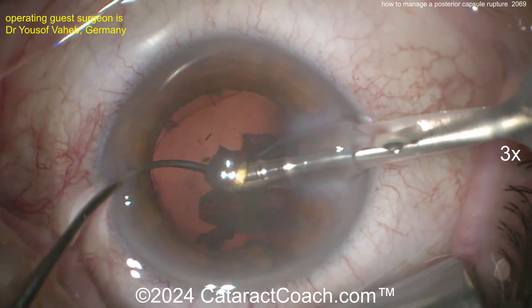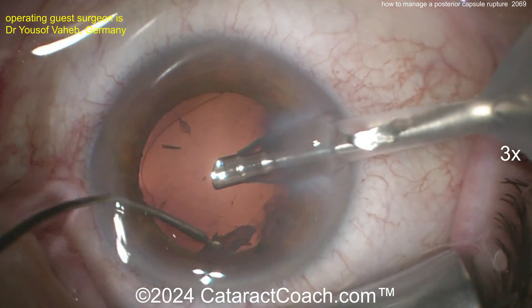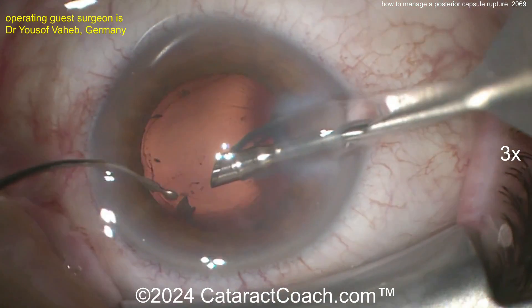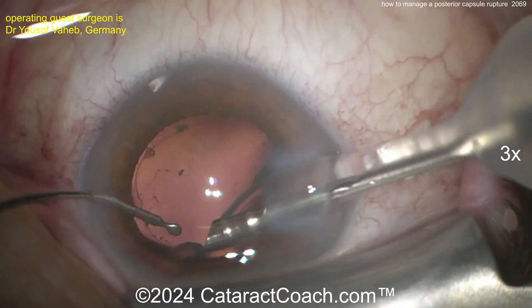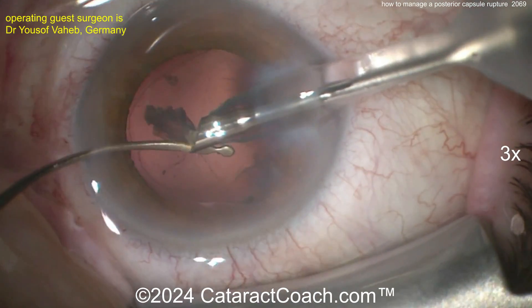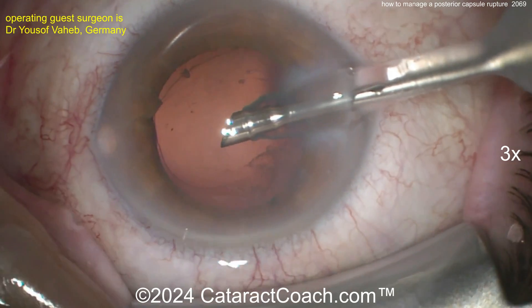The capsule is already open for sure. See those little tiny fragments going way back? Little tiny lens fragments are going into the vitreous. The capsule is definitely open right now — and you're entangled in vitreous right now. So you've got to be cautious here. This is where you want viscoelastic in that left hand.